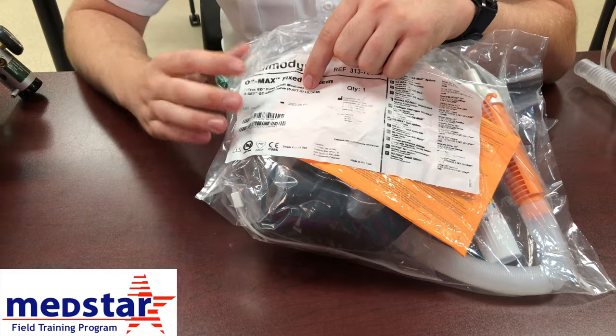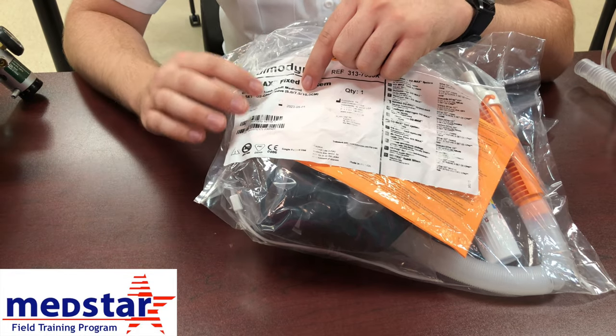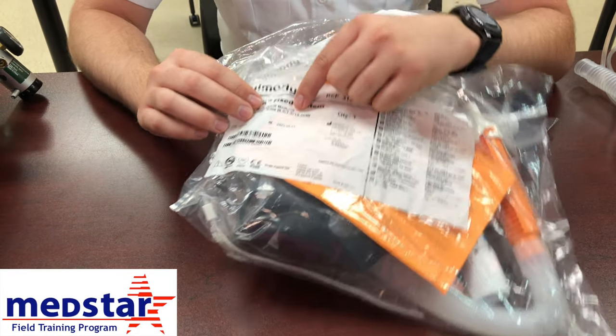If you accidentally grab the wrong size, it's all right. You don't have to redo the whole tubing and everything. All you have to do is get the correct mask from the other package.